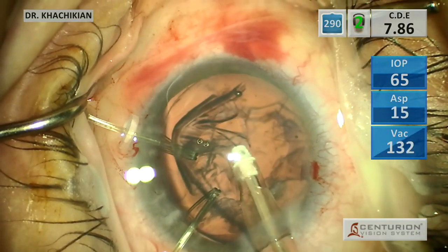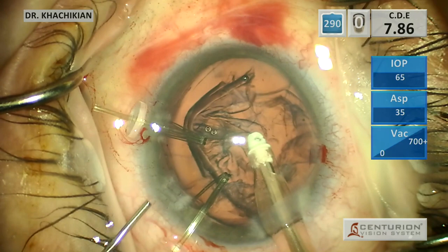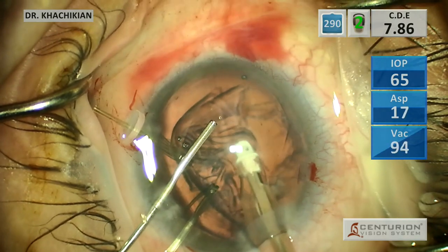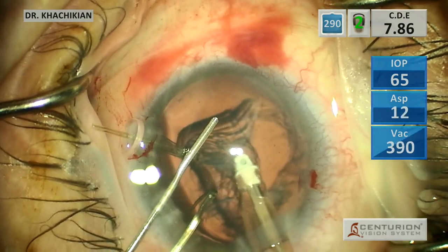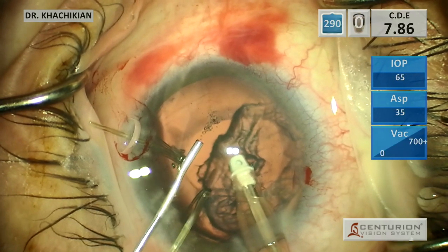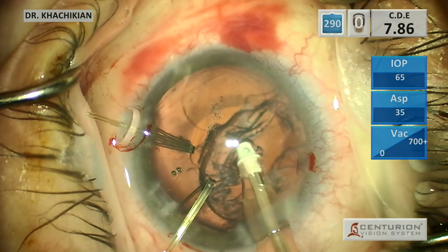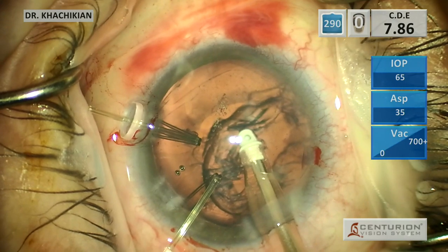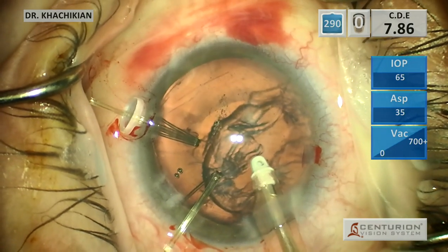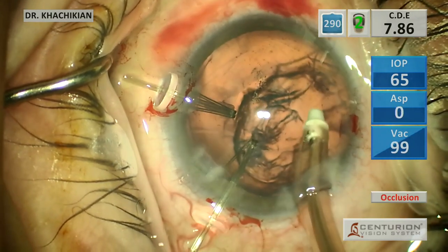I just kind of pointed to it - superior temporal there, you are pulling on the capsule and you can see the capsular folds. So we're going to get more viscoat in there to push the capsule back as we pull and use the IA to pull out the epinucleus and cortex. The cortex is coming out pretty easily - we probably had a good hydrodissection - but you can see there's viscoat going back there to keep the bag back. And you can see the capsular hooks are doing their job, especially that superior one, keeping the fornix of the capsule back while we remove the epinucleus and cortex.